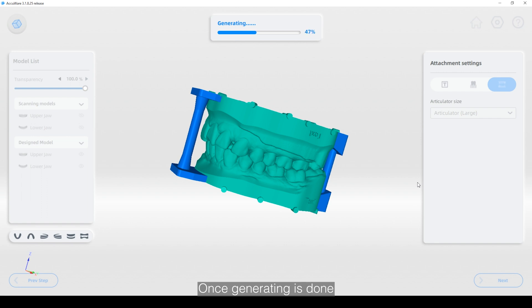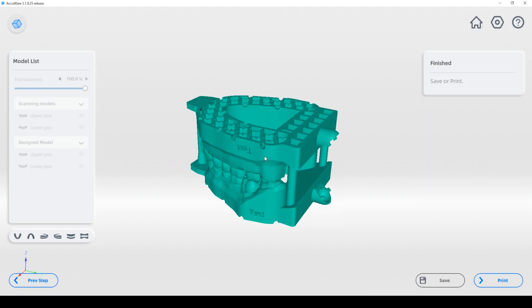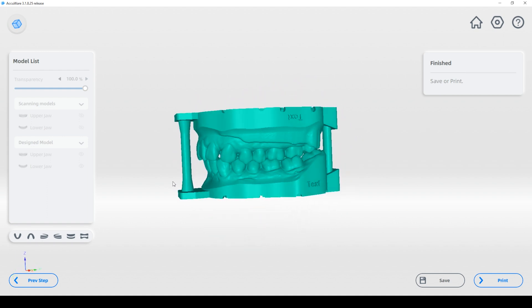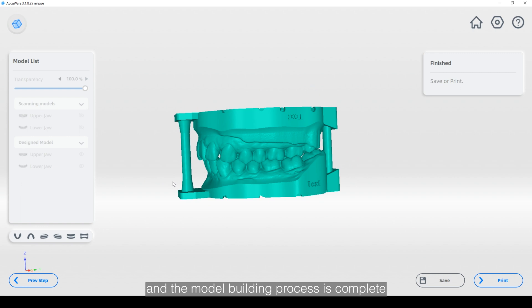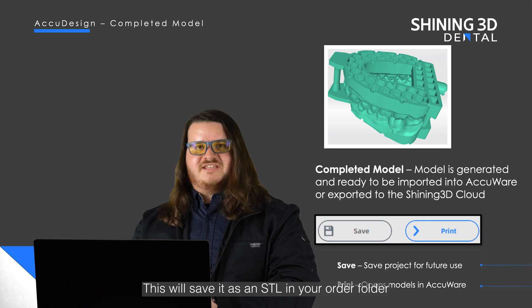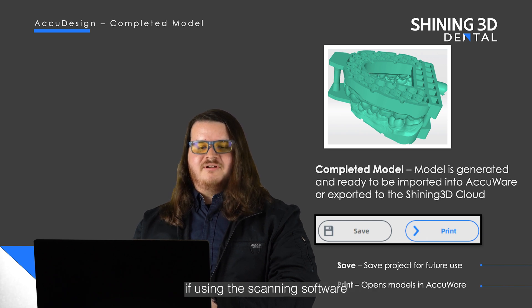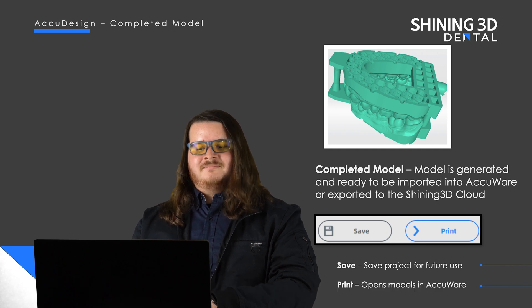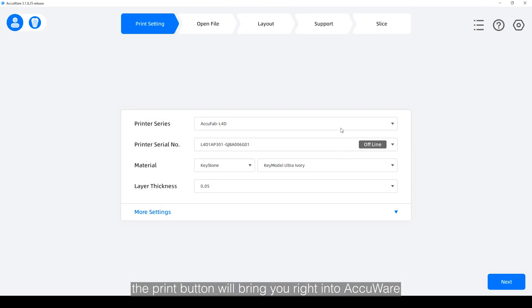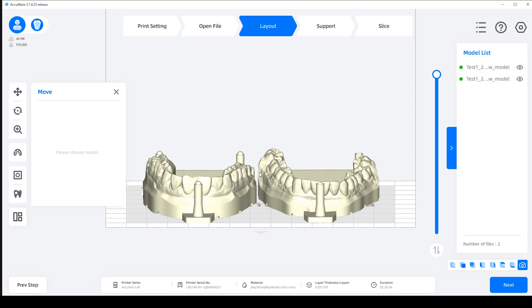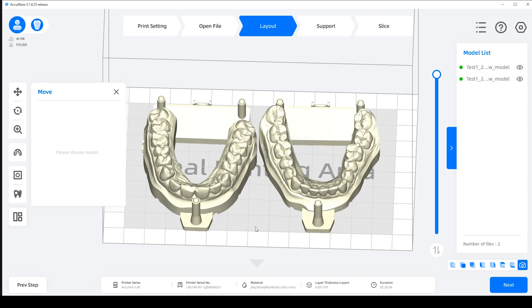Once generating is done you can see the final product, and the model building process is complete. At this step you can save the model, which will save it as an STL in your order folder if you're using the scanning software, or you can designate a folder if you're using the AccuWear version. The print button will bring you right into AccuWear and the model will be ready to print.